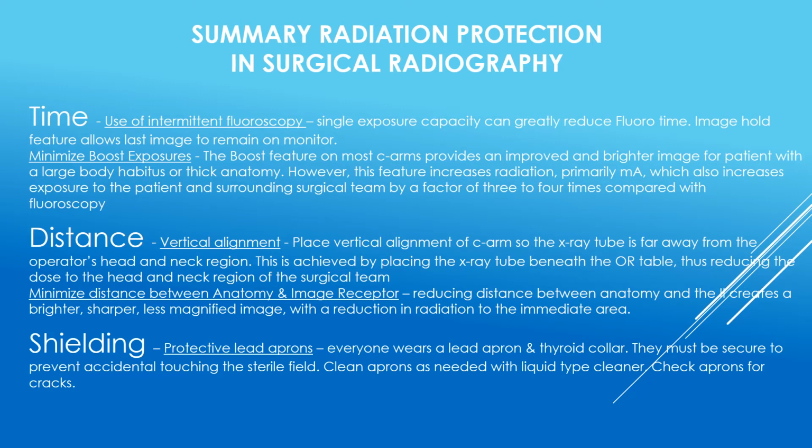Minimize distance between the anatomy and the II. Reduced distance between anatomy and the II creates a brighter, sharper, less magnified image with a reduction in radiation to the immediate area. Shielding, protective lead aprons.